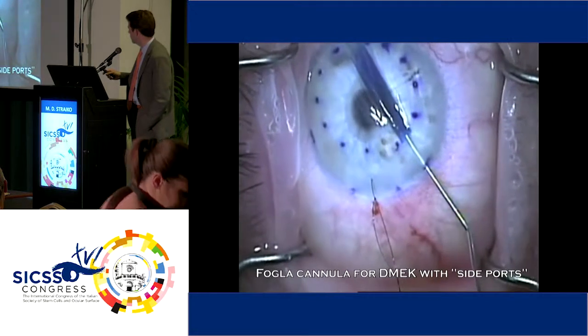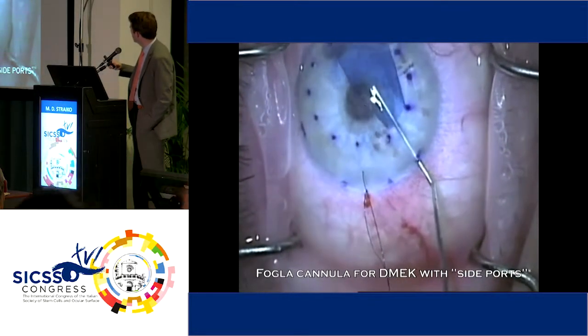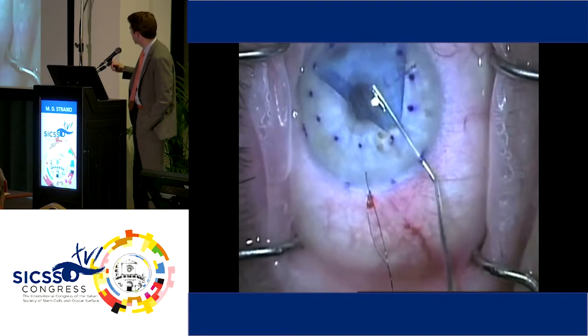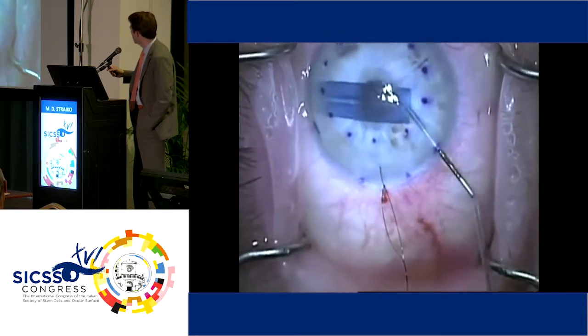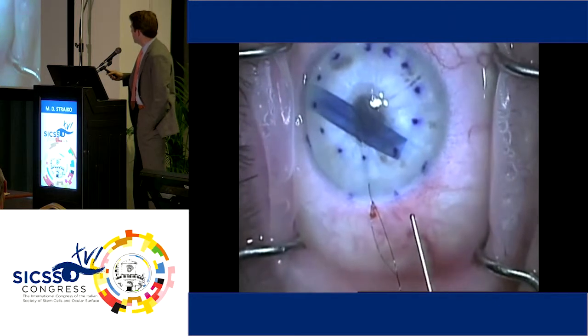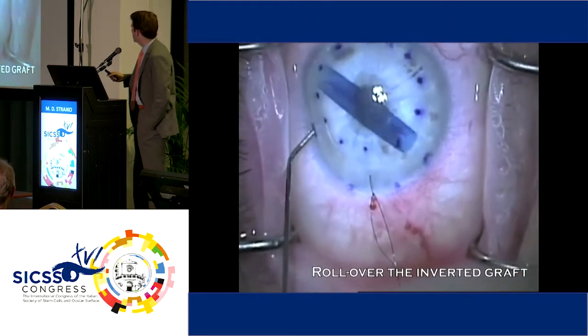Inject along the iris plane to roll the graft over, just short little bursts, with the graft central and in a deeper anterior chamber. Here I'm using the Fogla cannula that Rajesh Fogla developed. It jets fluid out the sides of the tip to help open a graft. Unfortunately, I opened it upside down. You can see the backwards S, otherwise I may not have realized that was upside down. And so I'm going to make sure the chamber is deep enough that there's room for the graft to roll over and inject along the iris plane.